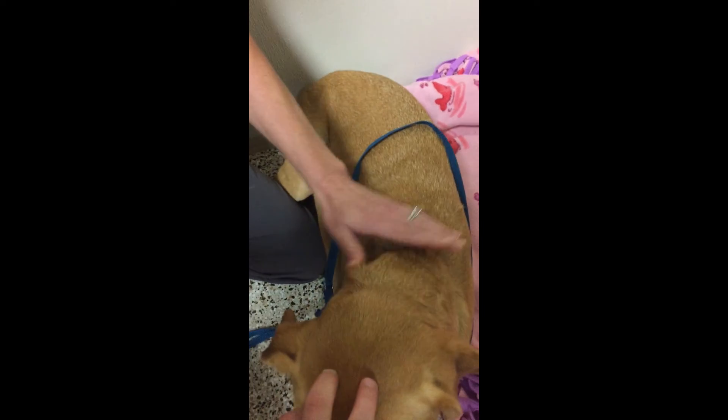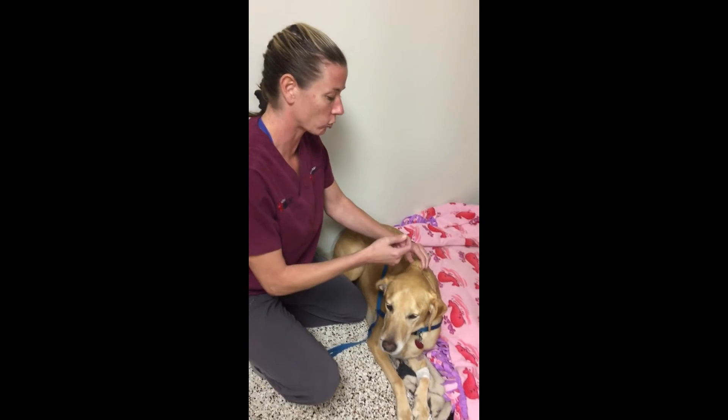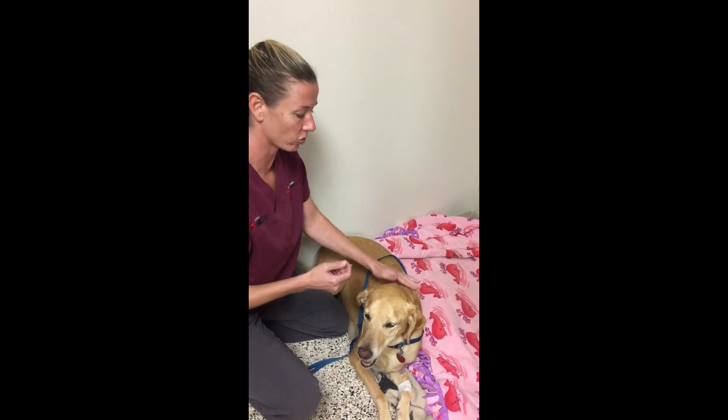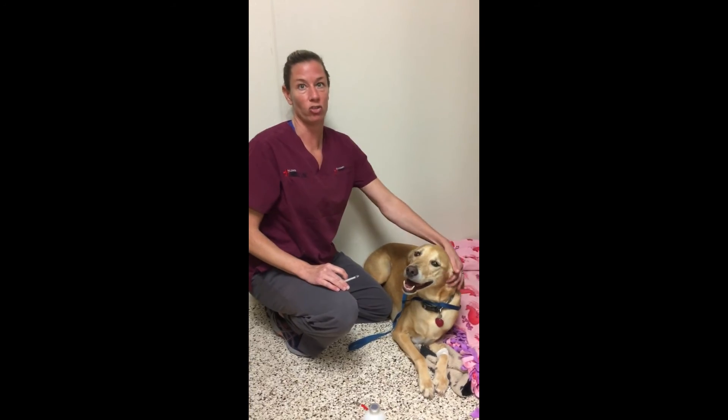After you give your injection, just check your little spot to make sure you actually got it under the skin and not just on his fur. So that's Toby, and that's our insulin injections.